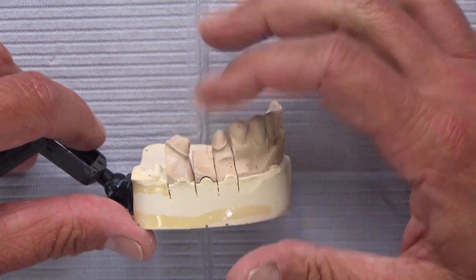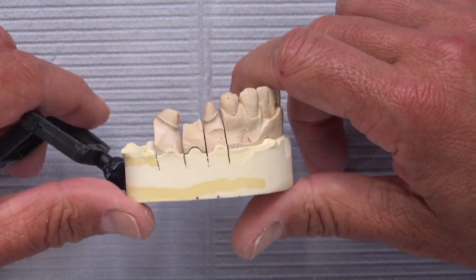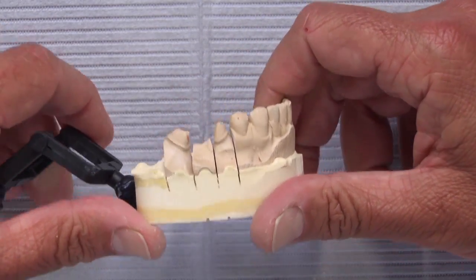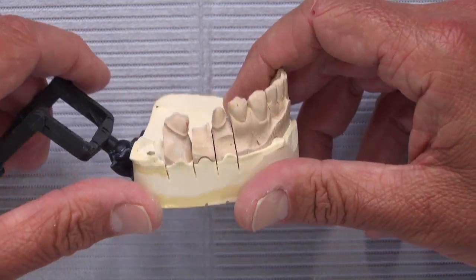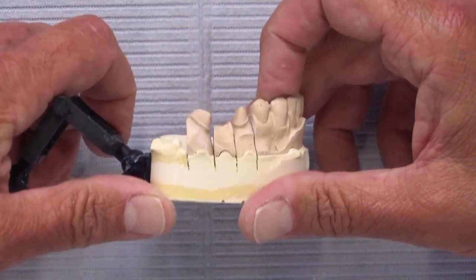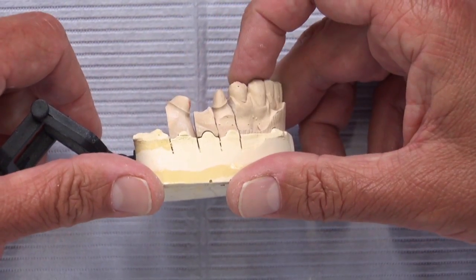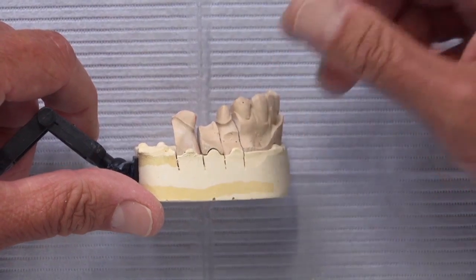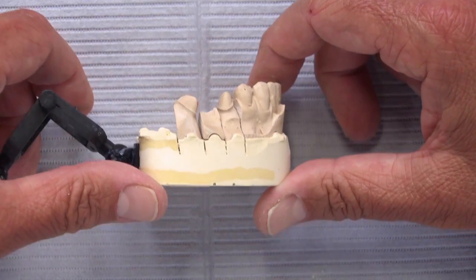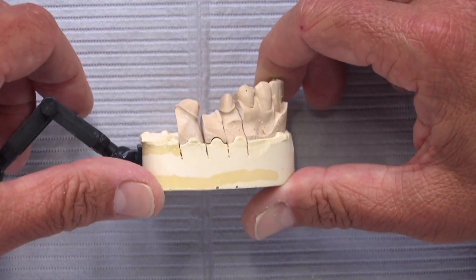As we look at the prep live with the scanner image, our software tells us where the undercuts are. We can say 'Doctor, can you go in and prepare the mesial of that molar and tilt that angle back toward the distal?' The doctor does that, dries everything off, puts the camera back in, and we capture that and put it into the software. We give feedback like 'just a little more right on the mesial facial,' the dentist does it, and then we say 'the undercut is gone, go ahead and take your digital impression.'